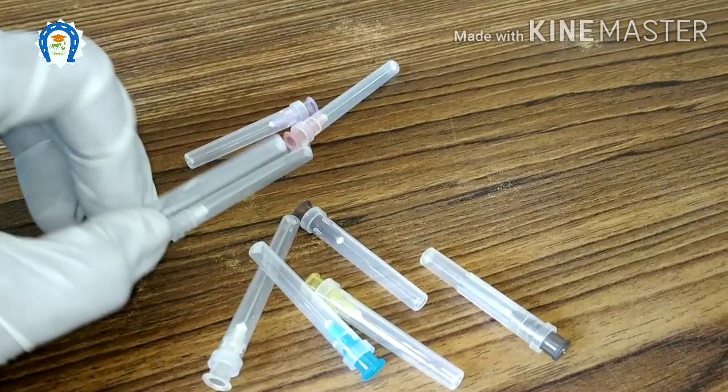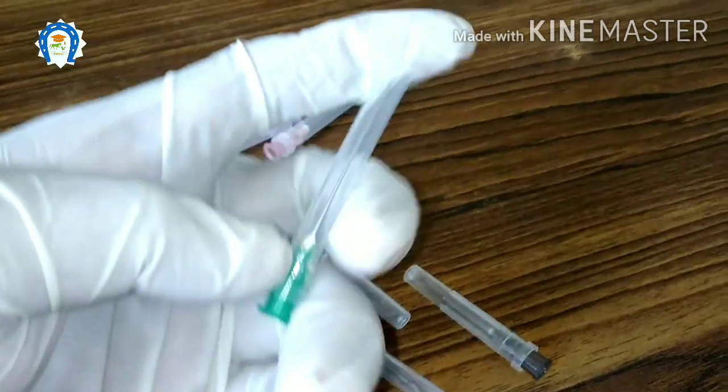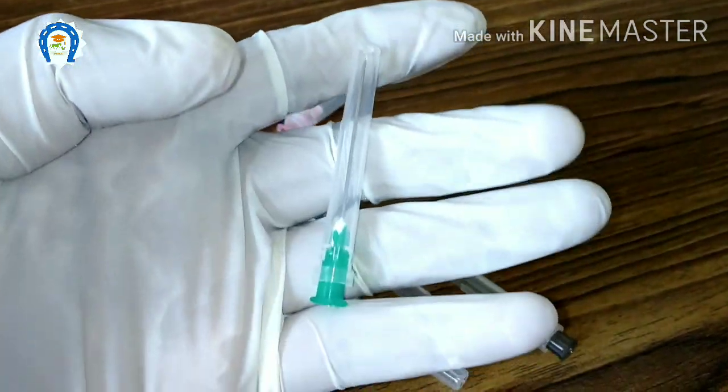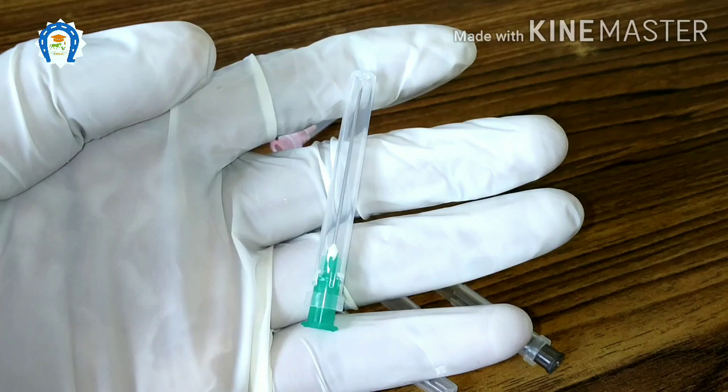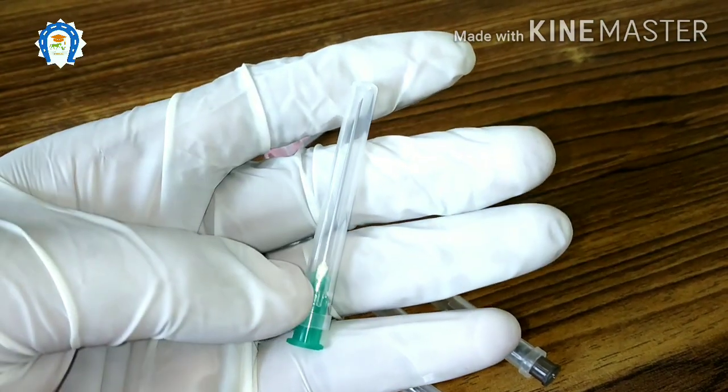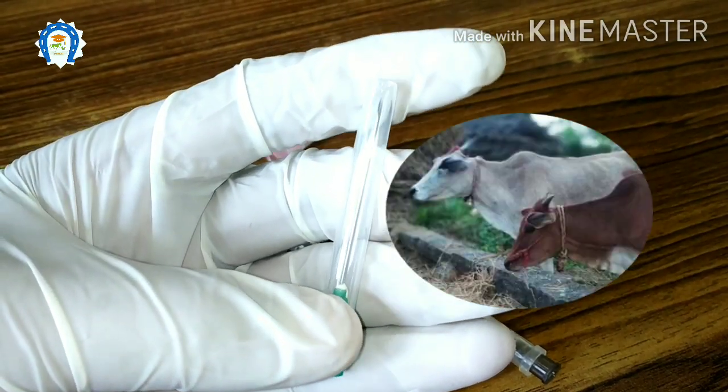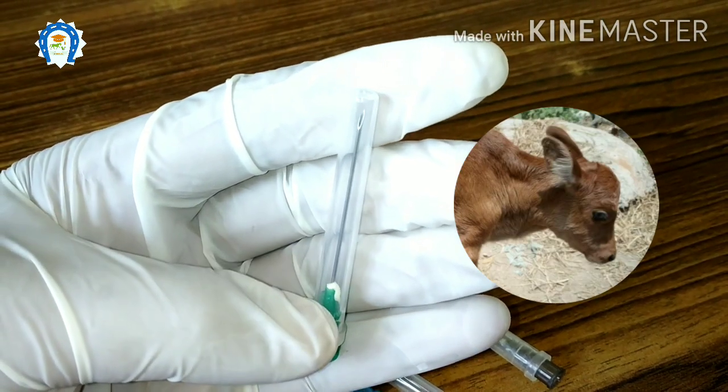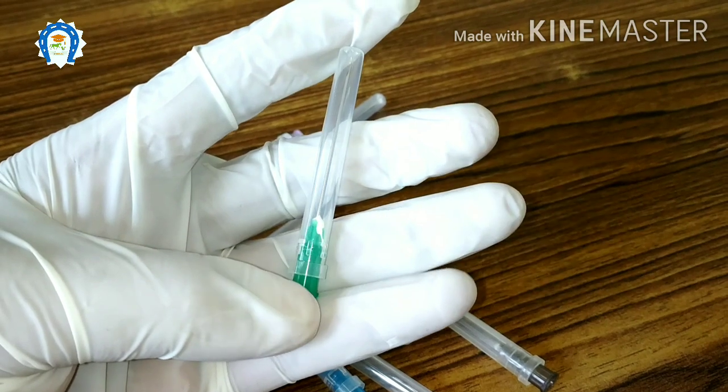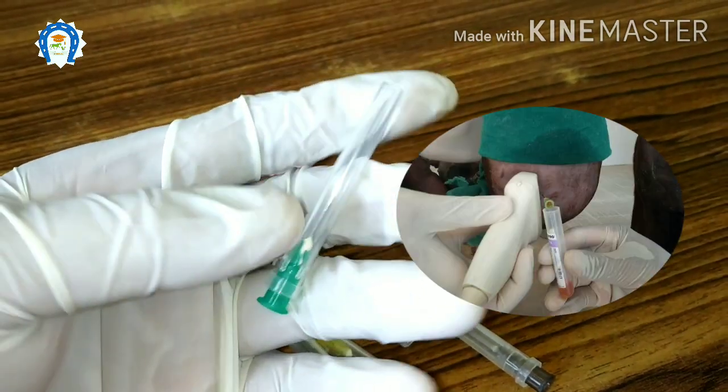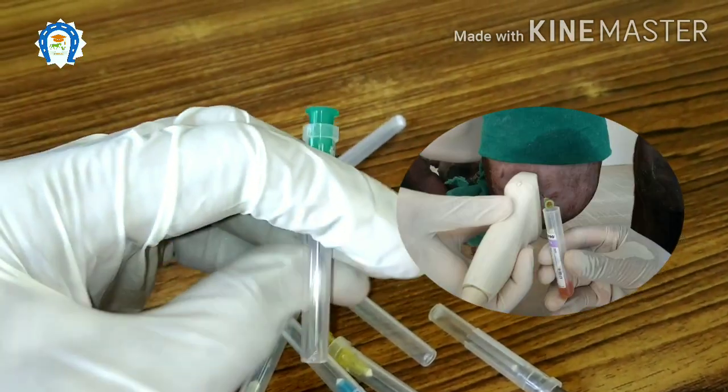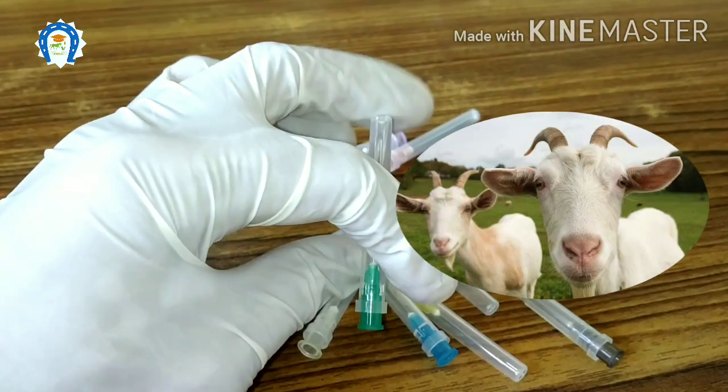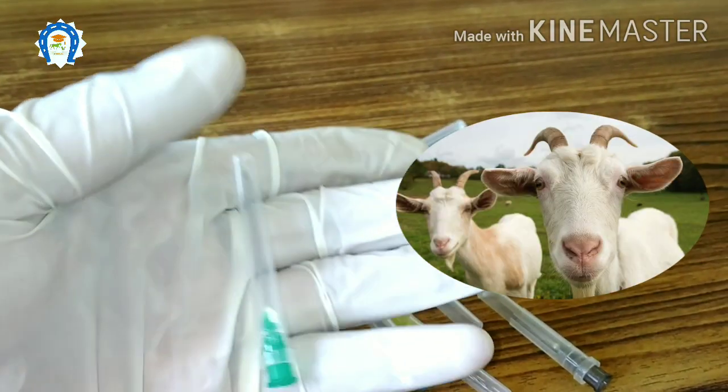Then the green color needle, that is the 21 gauge needle. This is very useful in large animal practice. We can use this needle for blood collection in horses, sheep, goats, and young cows, and we can use this for intravenous and intramuscular injections in cows, goats, and sheep. This is an ideal needle for intra-articular injections in horses and cattle. In sheep and goats, it is used for epidural injections.